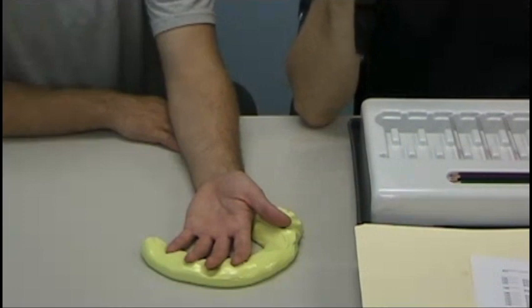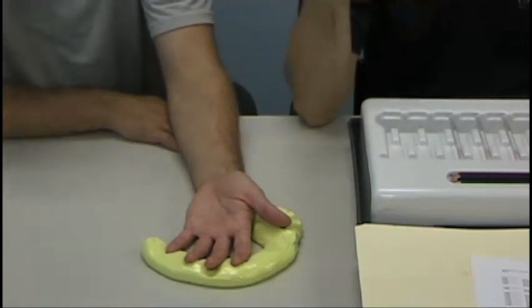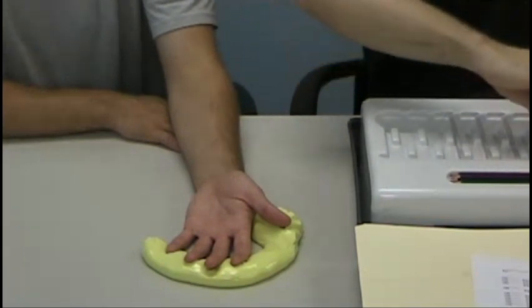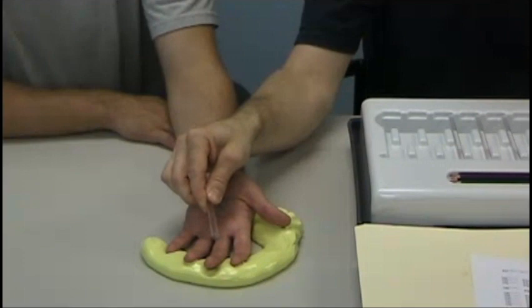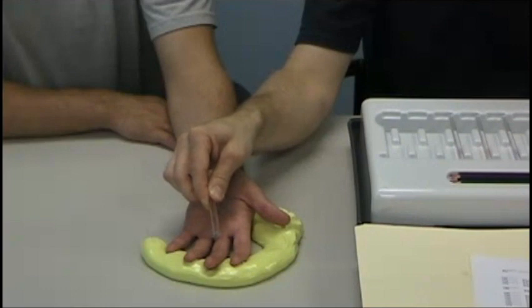The filaments 1.65 through 4.08 are applied three times. You apply it till it bends, hold for a second and a half, then release. Apply till it bends again, hold for a second and a half, then release. Apply again for a second and a half, then release. You do three successive applications in the same place, all in a row.